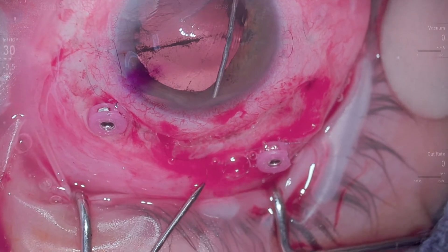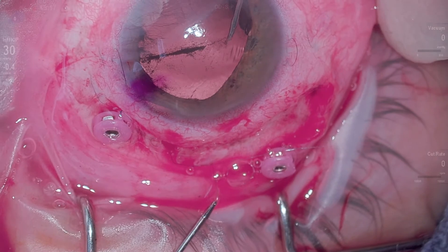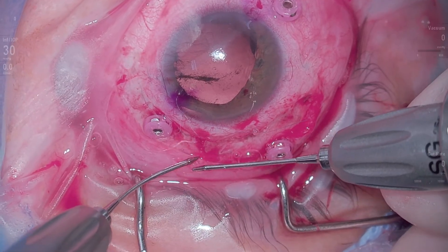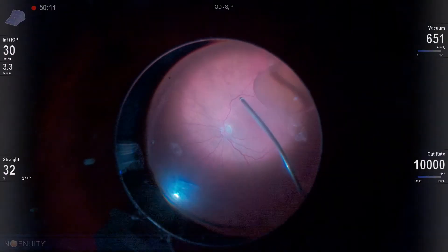At this point I've only made two passes on this round and the iris is looking pretty good, so I basically say: I'm just going to externalize this thing, tie it to itself. And we get a pretty decent-looking, round pupil.